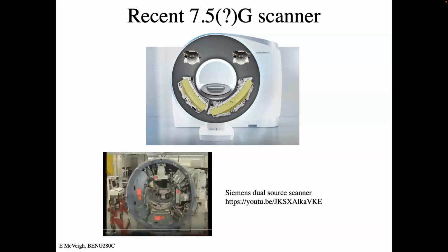And this is what's done in echo, it's done in MR all the time, is you take multiple beats and cobble them together to pretend there's a single beat, which is fine if the person has a very even rhythm, right? So their EKG shows an R to R interval that's reproducible within, say, 5% or something like that.